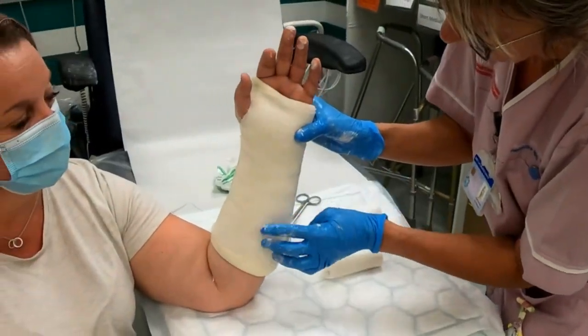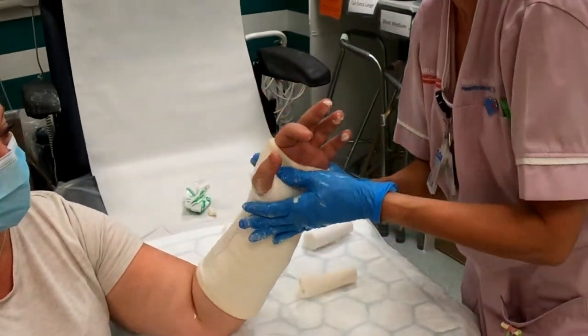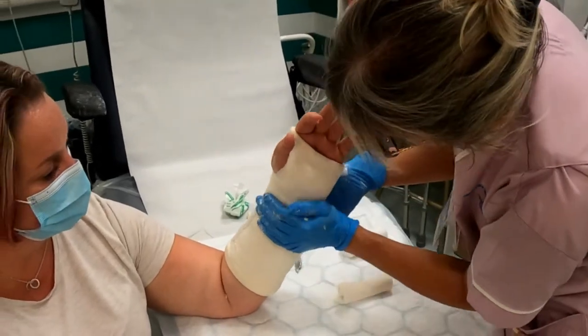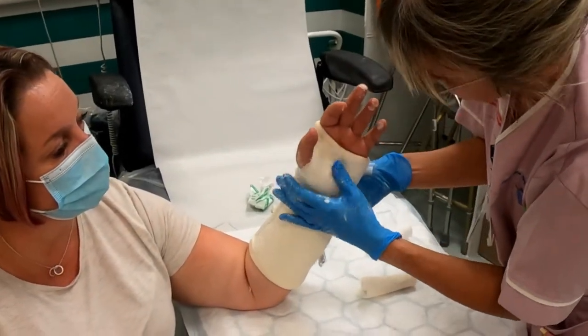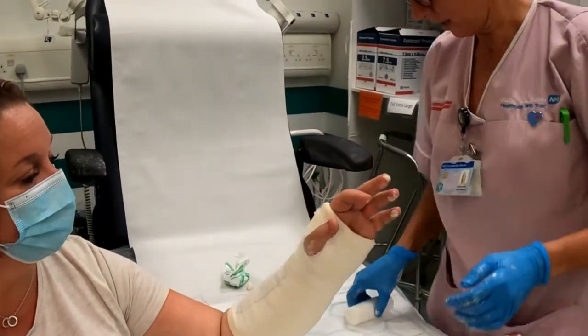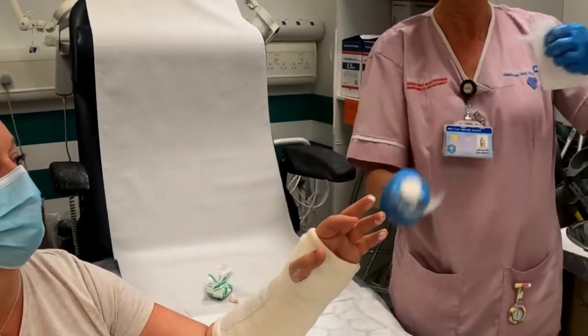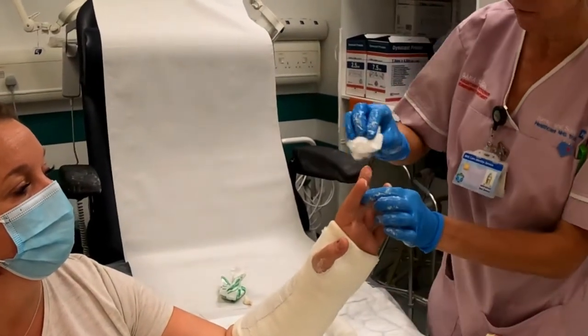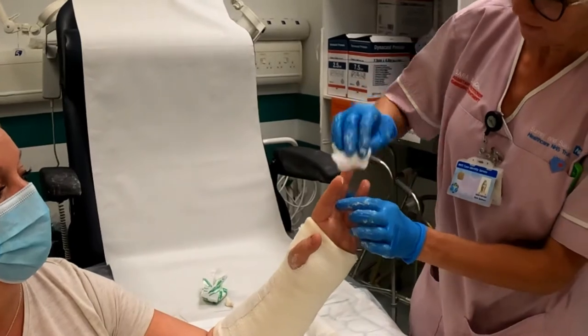Hold the cast in your hand and the securing piece can go straight over, sitting on top where your plaster is — because it's soft on the underside you don't want it there, otherwise you'd be completing it into a full cast. Check that everything's moulded nicely and sits into the palm. You can use a little bit of soft band, wet it in your water, and use that as a mop to clean all the fingers.